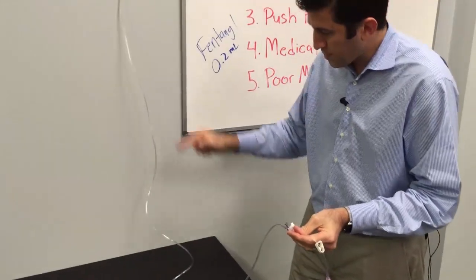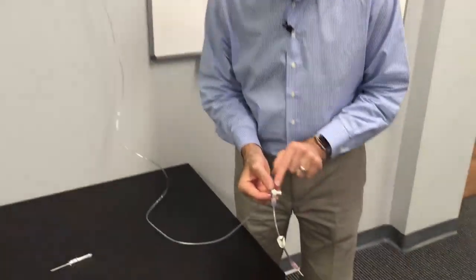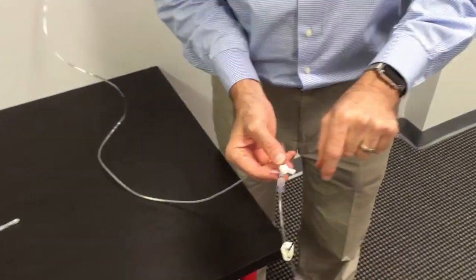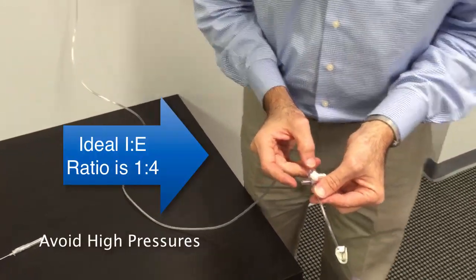Okay, now that you're on, and this is going to the tubing, to the oxygen canister. And now essentially, you keep the three-way off to nowhere. So essentially, the entire system is open. You have oxygen streaming through here. And essentially, every time you want to give a breath, you just cover that port.